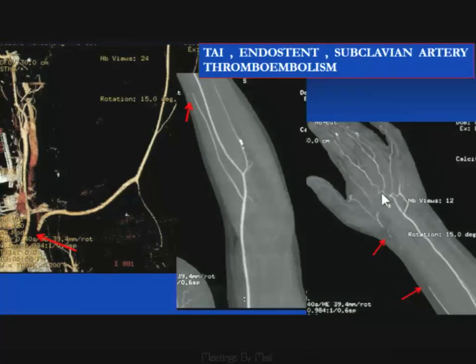We're into the palmar arch and the common digital vessels. We've got some backflow across here into what's called the radialis indicis and princeps pollicis vessels. So a very nice layout for the vascular surgeon of the extent of embolic obstruction of this radial artery. If anything needed to be done interventionally, that's well mapped out by this intravenous arteriogram.